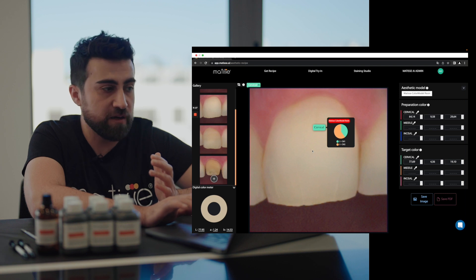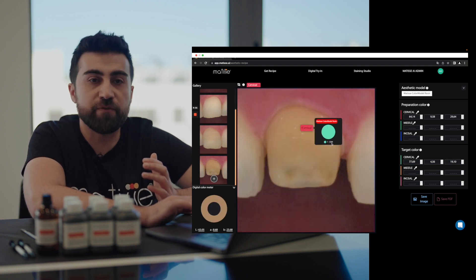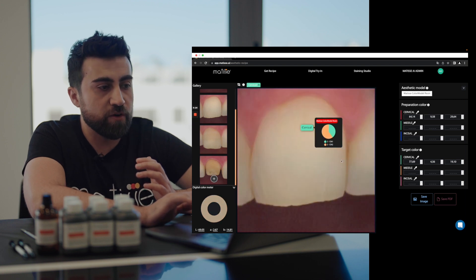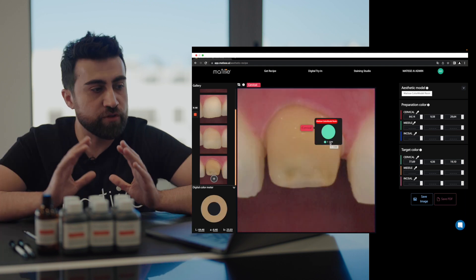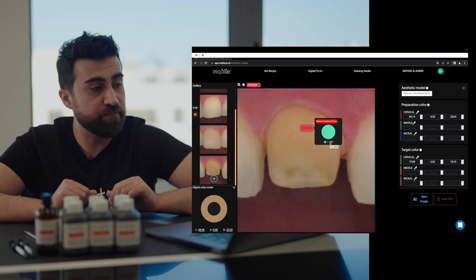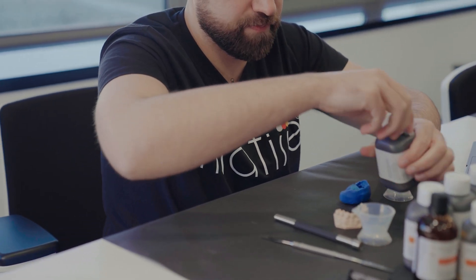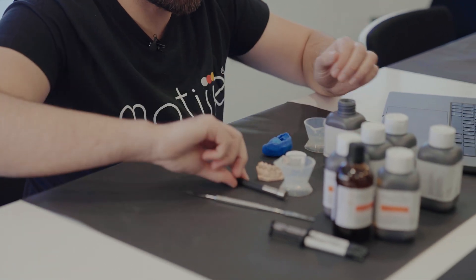So we have two recipes now. Preparation color is CM4, and target color is CM1 and CM2 with ratios of 2 and 3. Now I will fabricate the models and show you how easy this actually works. We need CM4 for the preparation color, so we use a mixing bowl with only CM4.